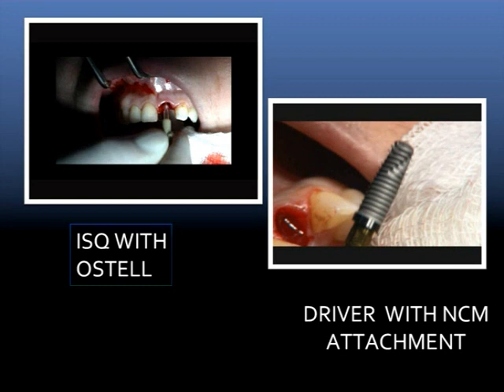And if you want to get real clever, you can compare the Osstell readings with the insertion torques. And there are obviously hand pieces that will measure this and graph things for you, and that's obvious if you walk around the clinic here, the exhibits.